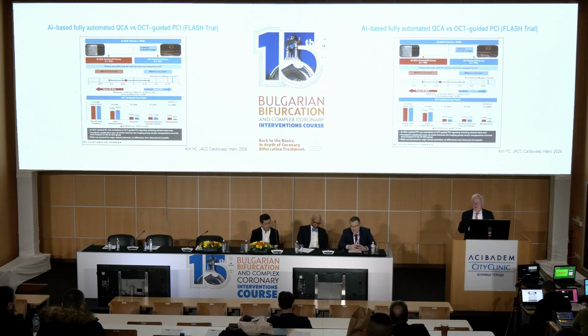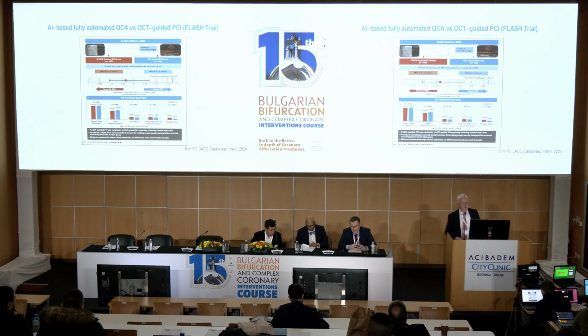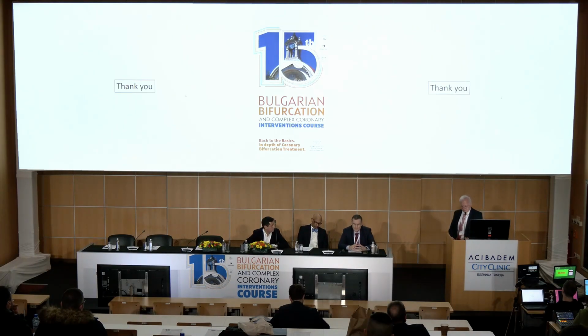Korean people are working on AI-based automated QCA versus OCT-guided PCI, the FLASH trial, 400 patients in both groups. There is nearly no difference, except on the right here, you have more malposition in the group guided by the QCA than in the OCT-guided PCI. But the mortality and every other strong factor are equal. Thank you very much.